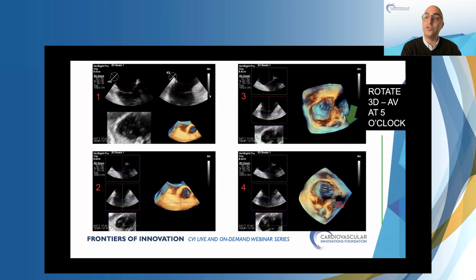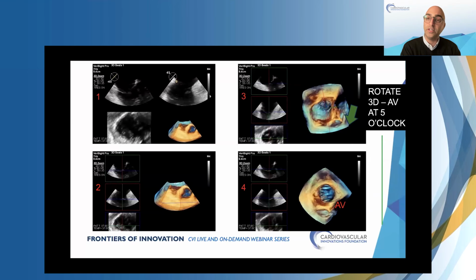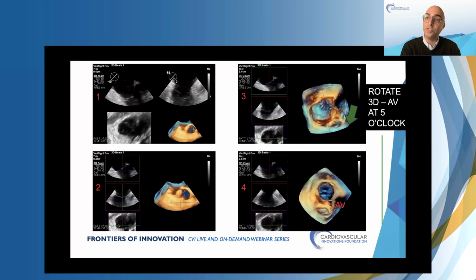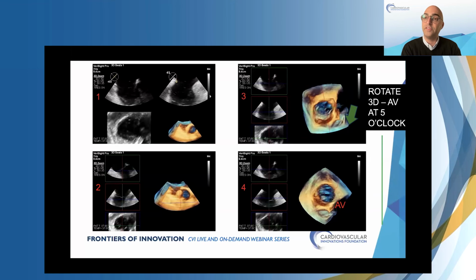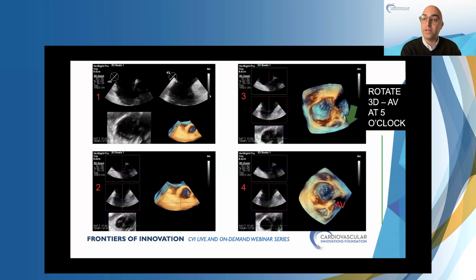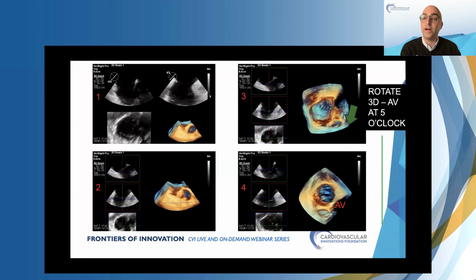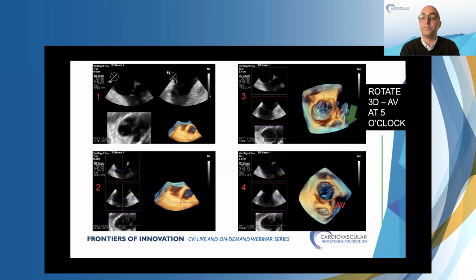In clip 3, you actually can see the aortic valve, the tricuspid valve, I'm sorry. But the aorta is not at 5 o'clock. It's typically at 3 o'clock. So then we'll Z-rotate it so the aortic valve is more at 4 or 5 o'clock, similar to a transgastric. Now what we're really looking at is that red plane and green plane, as Lynne showed really clearly. We're trying to see, how is our 45 minus 45? How are we cutting things? And just as a reminder, our green plane is minus 45, our red plane is 45.